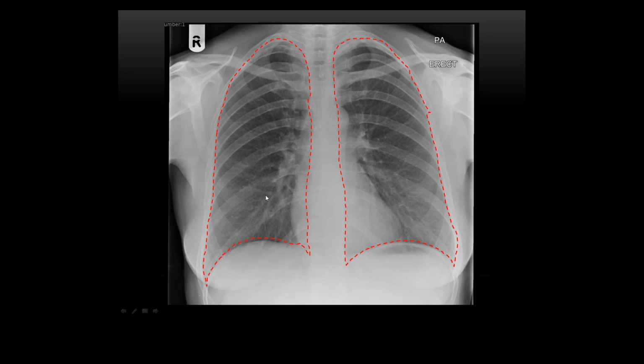In patients that are under 30, it's unlikely for them to be getting cancer, so we don't tend to arrange follow-ups for those patients unless we have a real suspicion of something going on. We might leave that for the referrers to decide clinically whether that infection has cleared, because we're not doing a follow-up chest x-ray to make sure the infection's cleared. We're making sure that the consolidation has not stayed the same or gotten worse, in which case it needs further imaging.